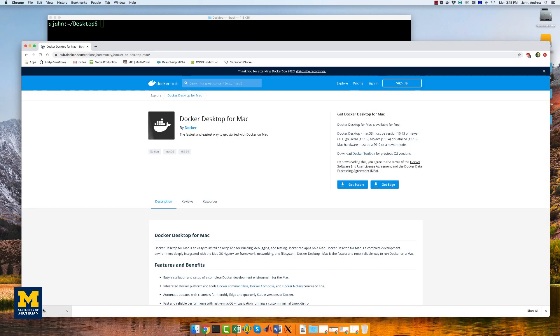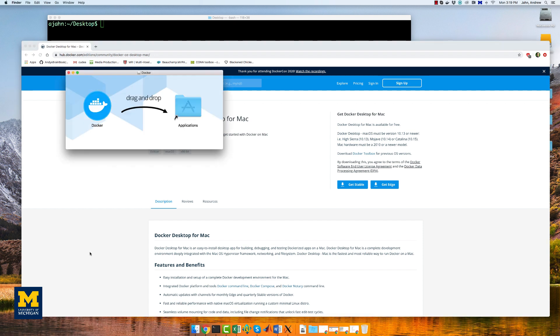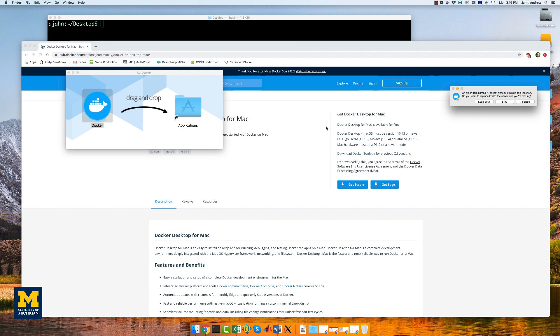When it has finished downloading, click on it to open the Docker disk image, and then follow the instructions to place it into your applications folder. I've already installed this, so I'm not going to go through that again.